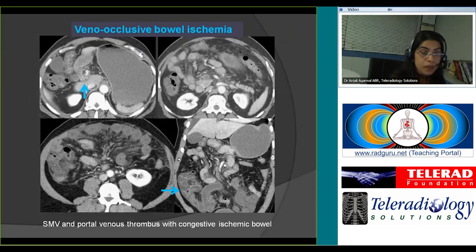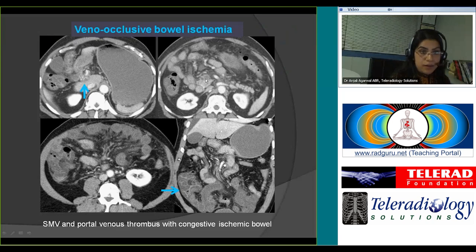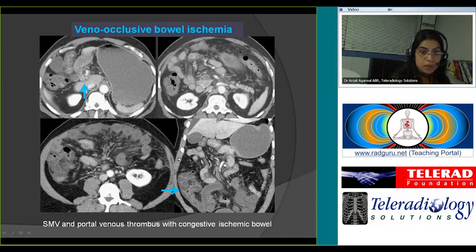An example of veno-occlusive bowel ischemia: there is a filling defect in the superior mesenteric vein resulting in extensive mesenteric congestion and bowel wall thickening due to the congestive state.